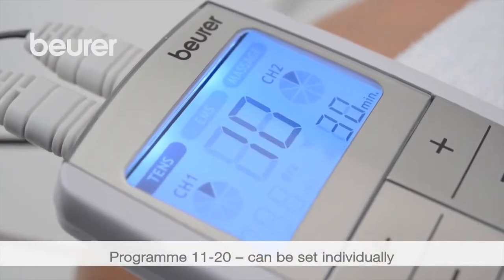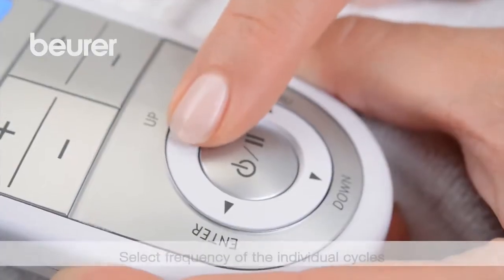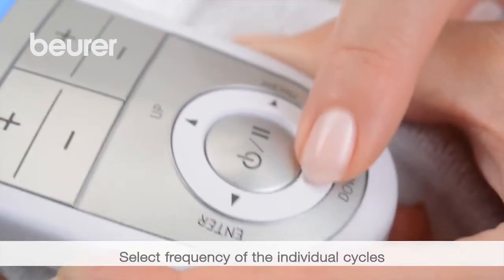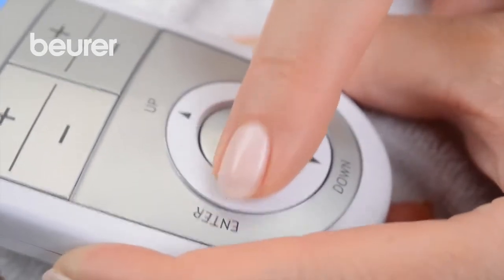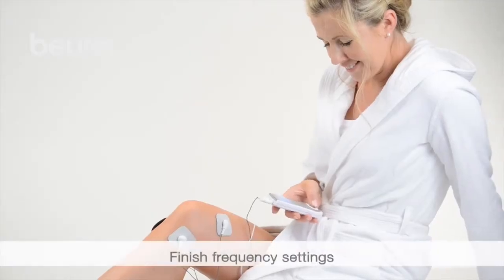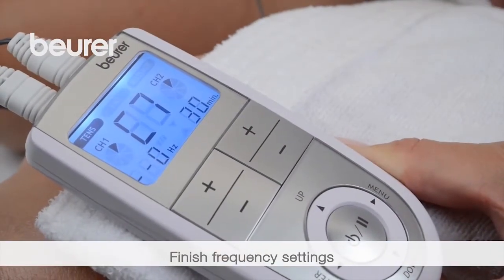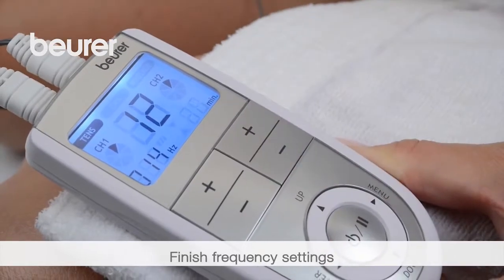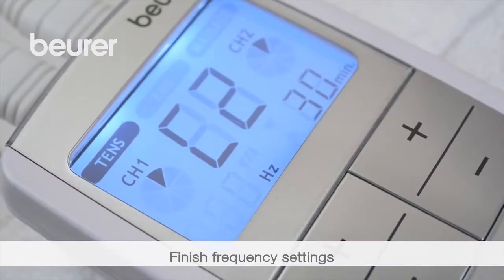For programs 11 to 20, the impulse frequency can be set individually. Select the frequency for the individual program cycles using the Up-Down button and press Enter to confirm. You finish the frequency setting by setting the most recently used cycle to 0 and pressing Enter. The frequency settings of the other cycles are automatically set to 0.